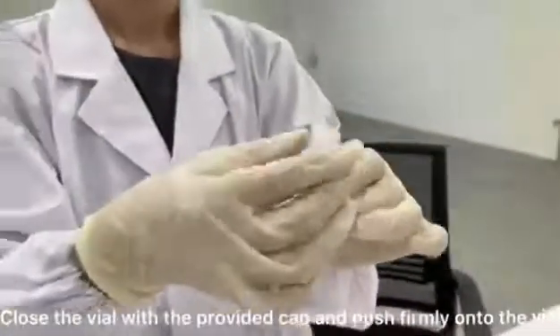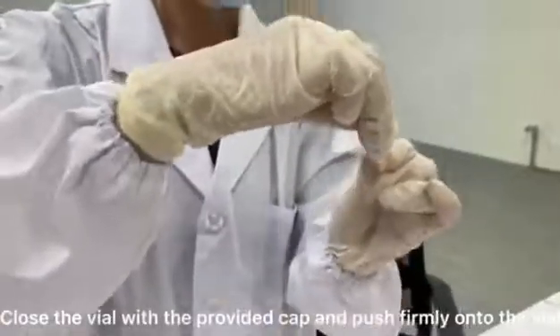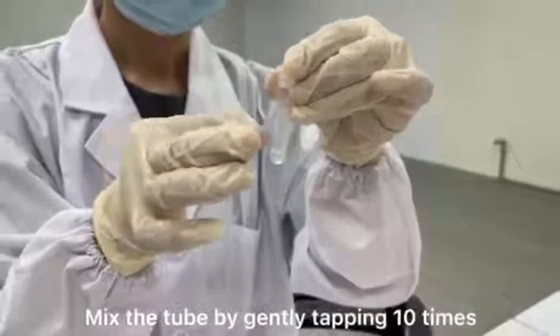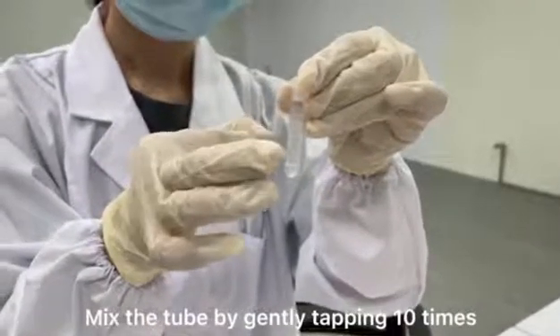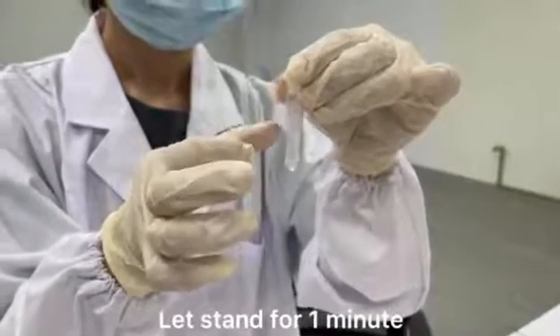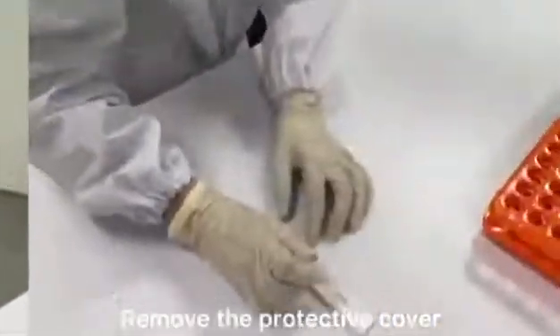Close the vial with the provided cap and push firmly onto the vial. Mix the tube by gently tapping ten times. Let stand for 1 minute. Remove the protective cover.